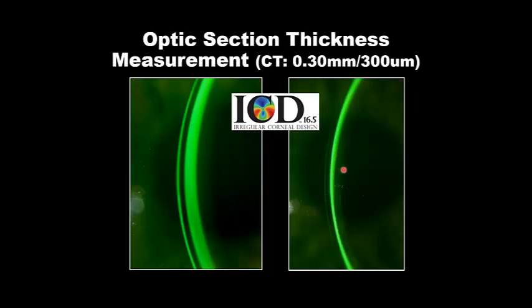You could use the thickness of the cornea, but of course if we're dealing with the corneal thinning disorder, we may not know the actual thickness we're dealing with at a particular area. So always better to use the thickness of the lens. In this case, our lens at the apex looks very similar to the posterior fluid. Maybe this thickness is slightly less than this thickness.